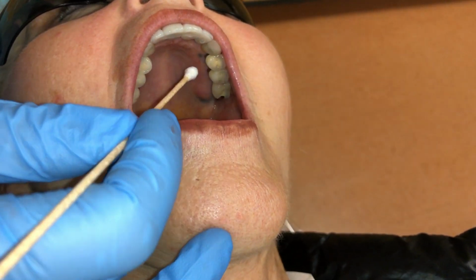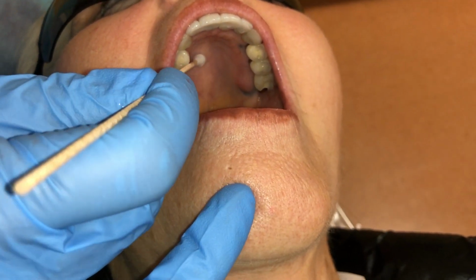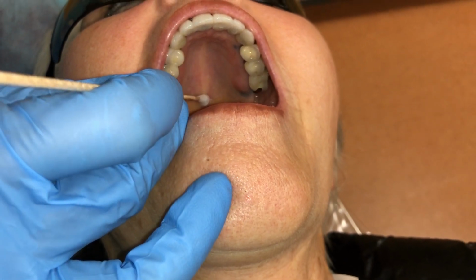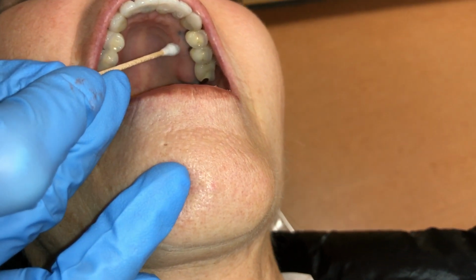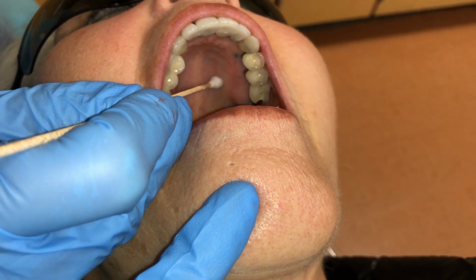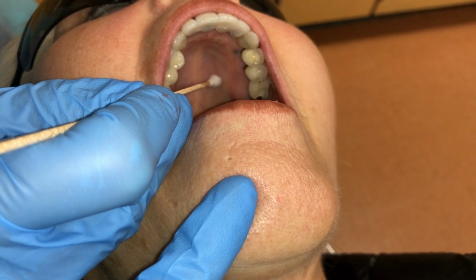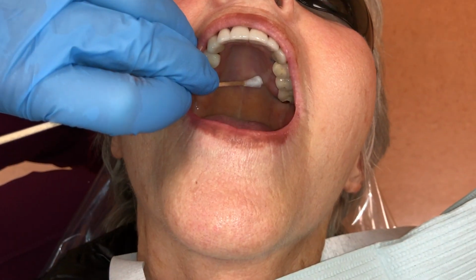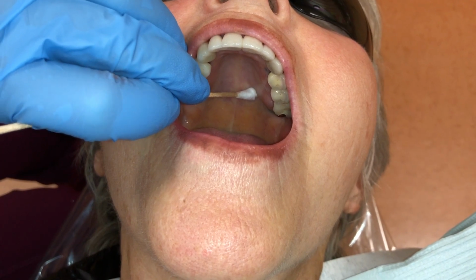The video demonstrates the clinician finding an appropriate location on both right and left sides. This location could vary based on the patient's tissue, palatal vault, and spongy location, somewhere between the gingival margin of the premolars and the midline palatine suture.